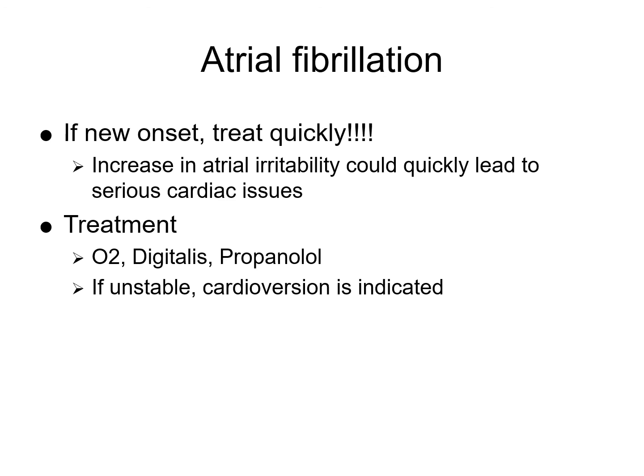So if you do a biphasic at 200, it's just as effective as a monophasic at 360 joules. However, there's less damage to the myocardium and less incidence of skin burns with the biphasic. Basically, with the biphasic the current is delivered in two directions, whereas the monophasic is delivered in one direction.